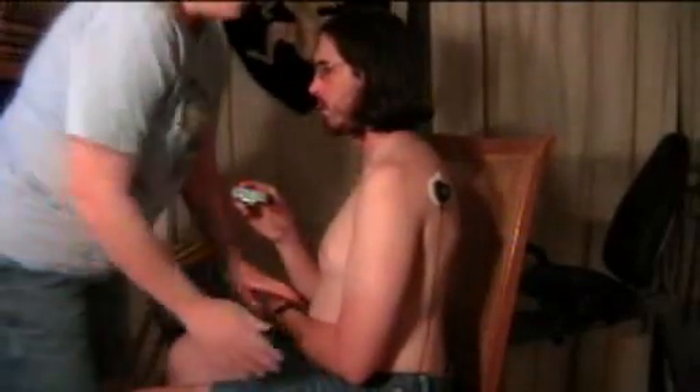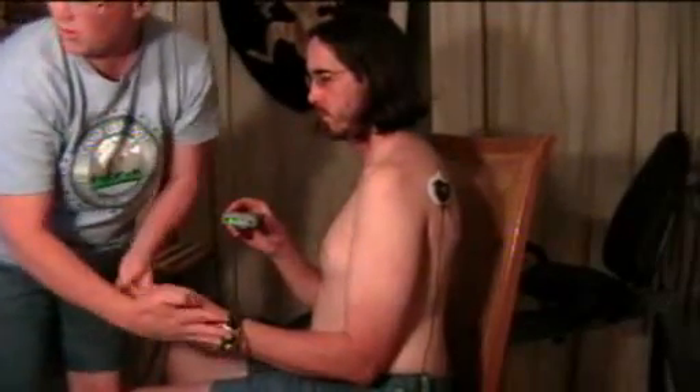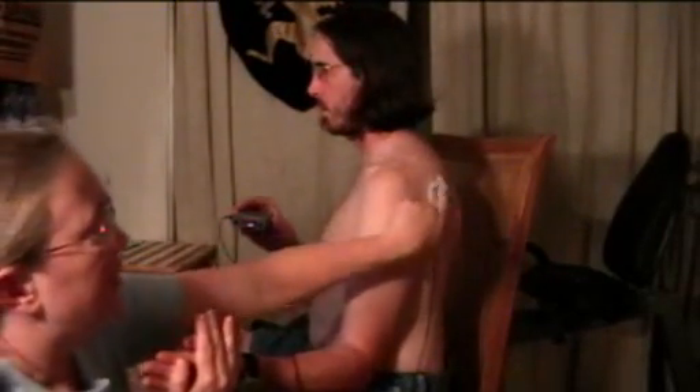The other thing you can try and do, depending on your range, is get someone to actually help you open the arm as far as it will go, and then try and continue to open it from there. Push against my palm, and try and open it from there. Then sequentially, turn the arm out as far as it will go and keep working it out until you are at the limit of your range, and you can still activate this muscle.